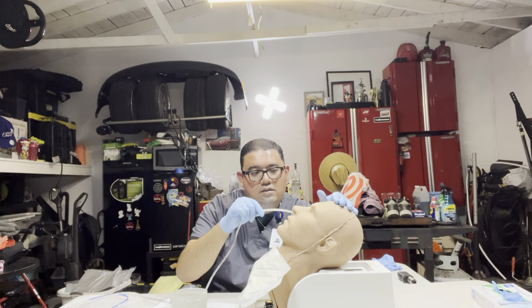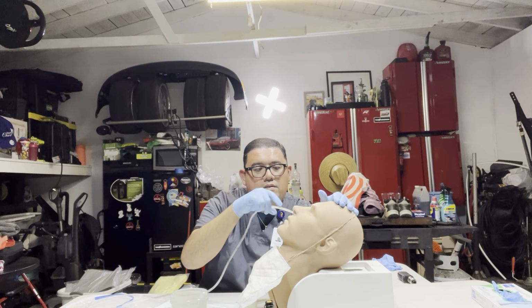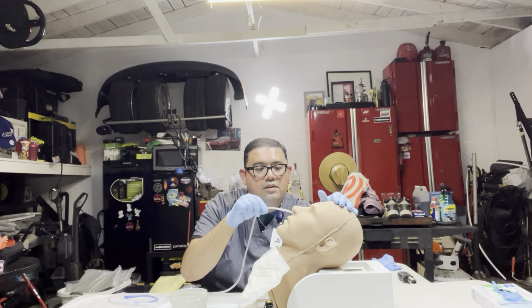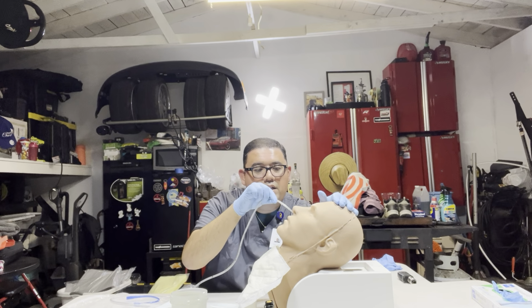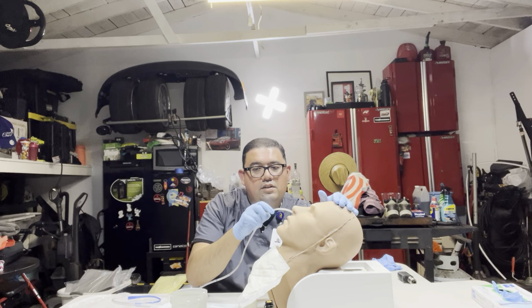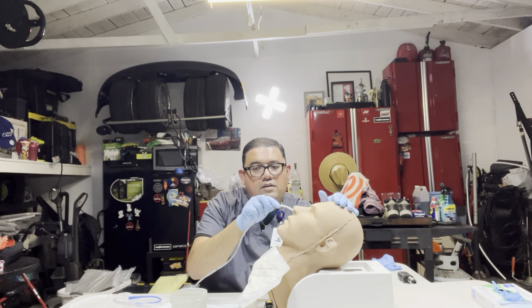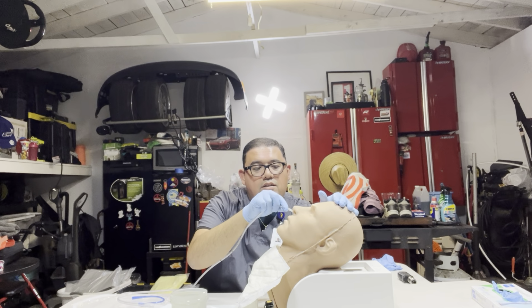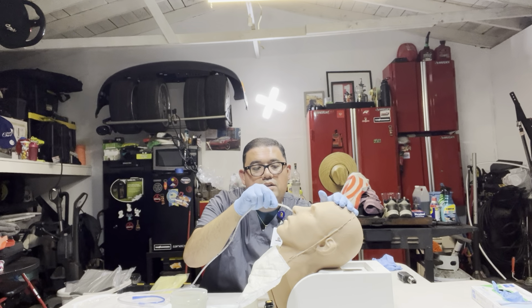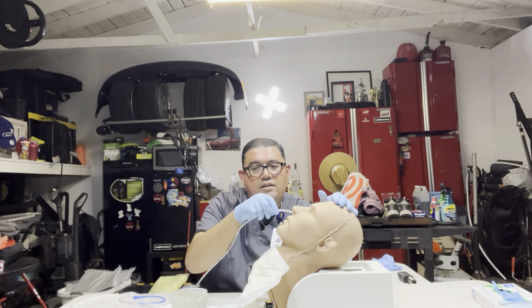So as we insert, okay, Mr. James, having a bit of discomfort or pain. So we'll go ahead and advance the tube. If we're met with any resistance, we want to withdraw the tube back and then try to advance again if needed.